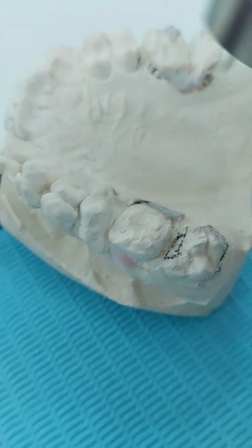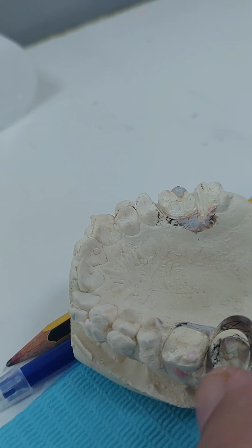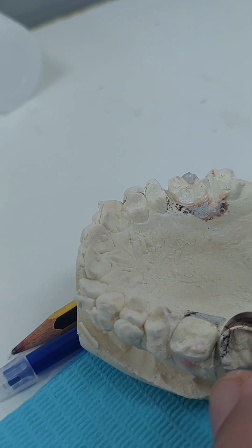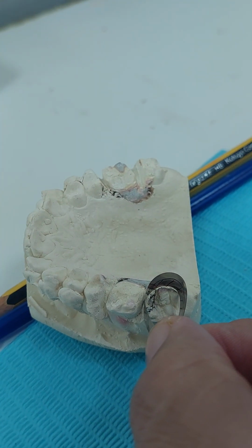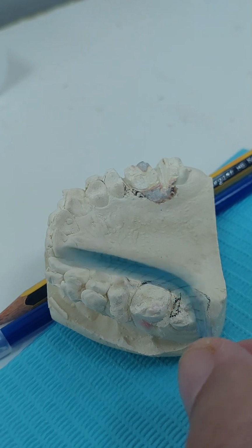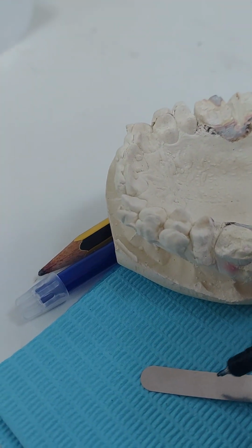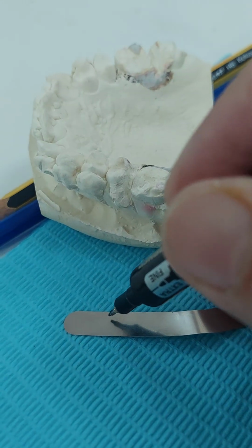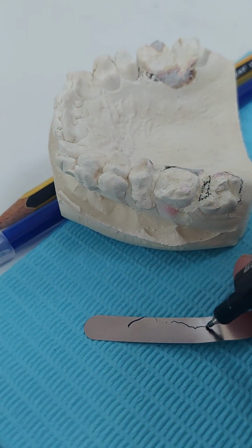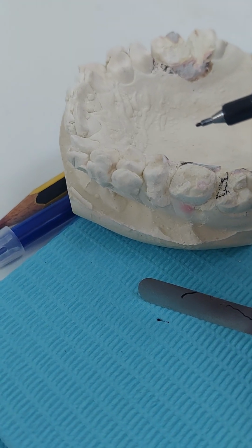Okay, let's show from here. Suppose this is the gingiva, and I'm going to place it here. What will happen? The gingiva buccally and palatally and distally will prevent me from seating. One of the ideas is, why not keep the area that's going to go into the deep marginal gingiva, leave it deep, and remove all of the edges from the rest. It will give you some adaptation.